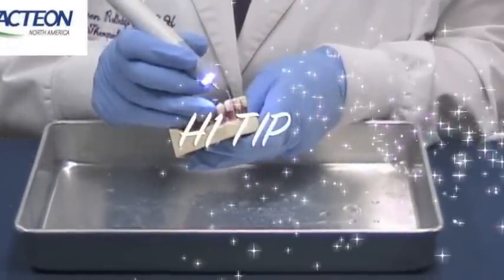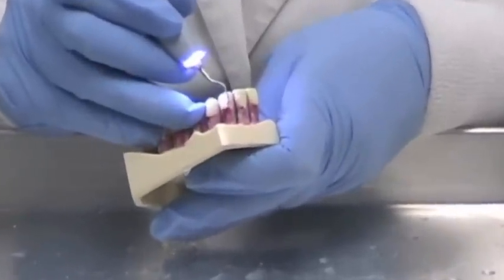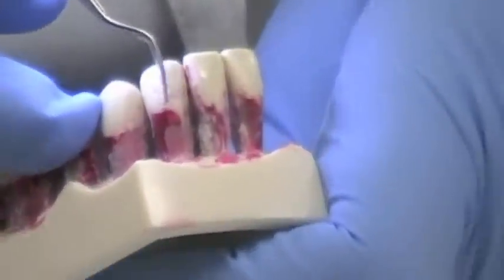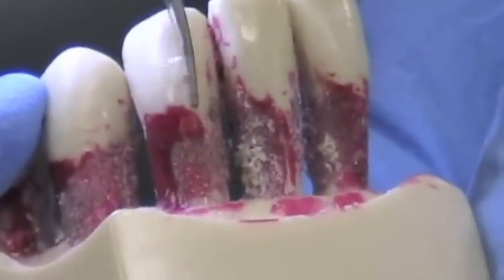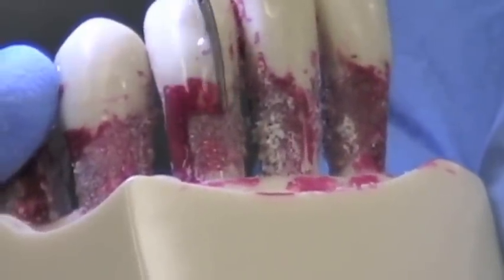Now we're going to demonstrate the H1 tip. The H1 tip is for anterior teeth. It's used for burnished calculus, for conservative root planing, and for smoothing the rough CEJ.